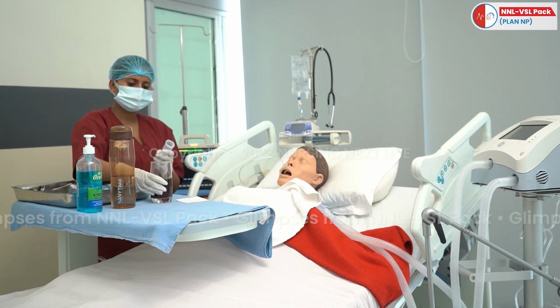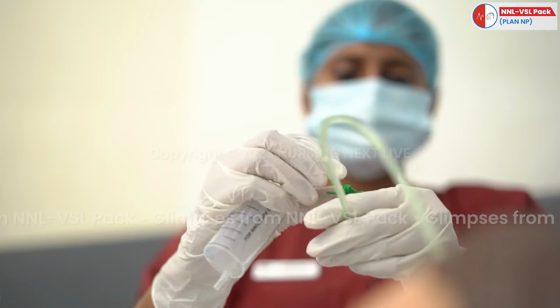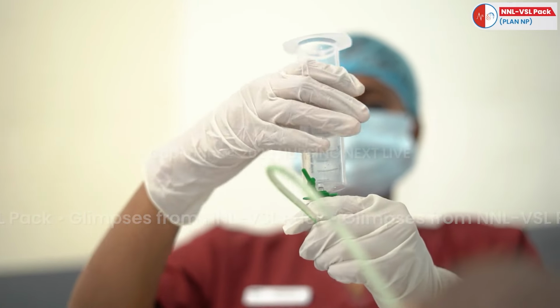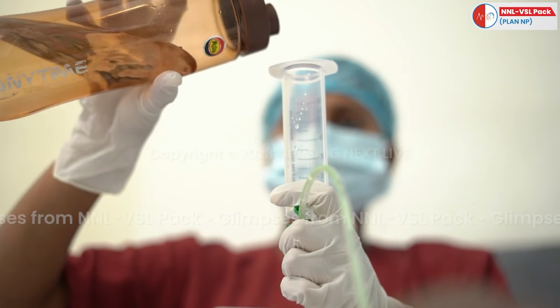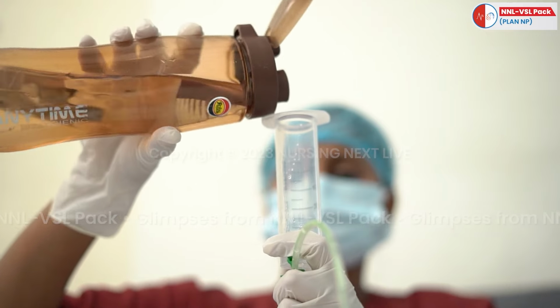Prepare the feed according to the diet chart. Checking the feed's temperature is necessary. Kink the NG tube and attach the 50 cc syringe. Kink the tube and free flush the NG tube with water in an appropriate amount sufficient for clearing the tube.